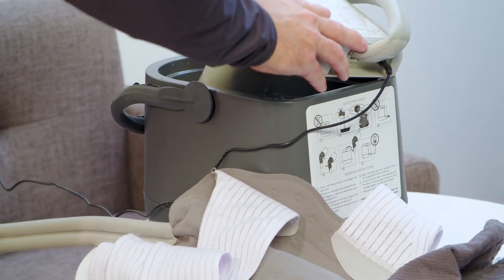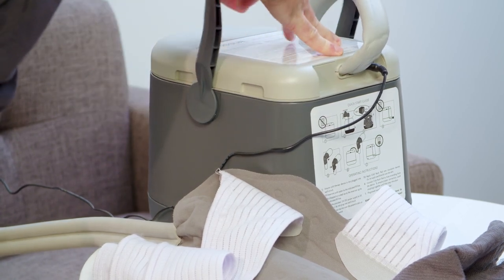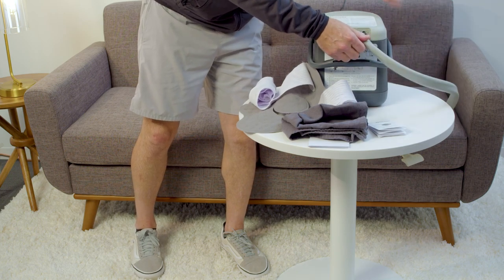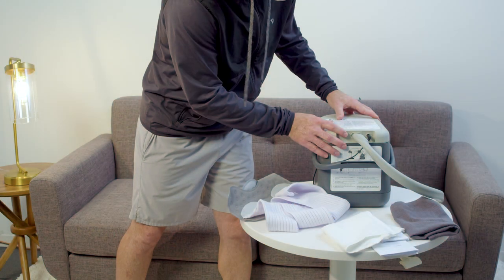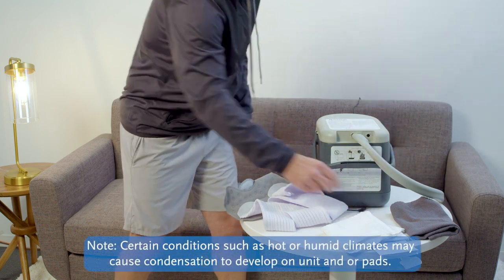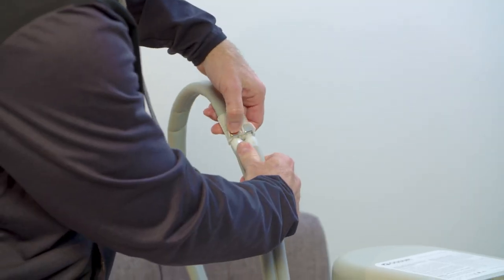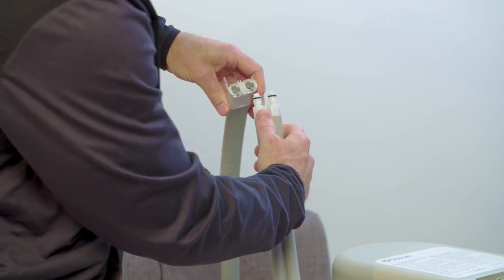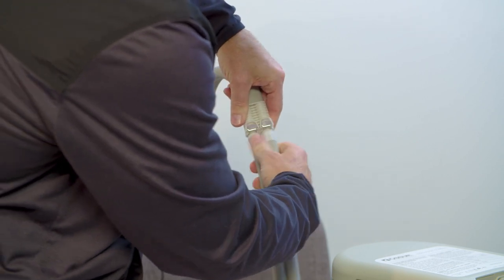If no water is flowing, make certain the unit is properly filled — refer to filling instructions. Check to ensure that the hose is not kinked or pinched by any object. Unplug the device, disconnect the hose, and visually inspect to ensure the coupling connectors are in the open position. Then reconnect the hose — a snap or clicking sound indicates proper connection.